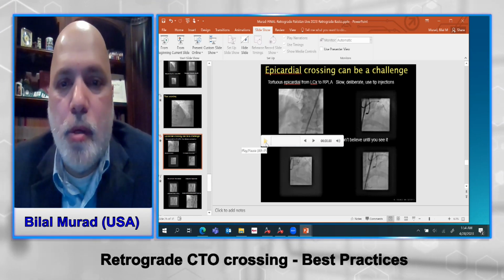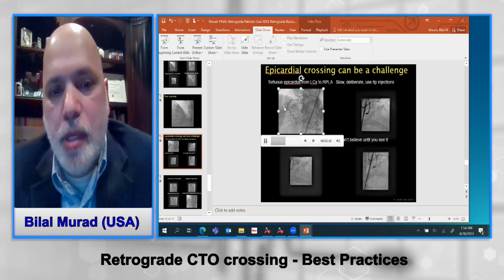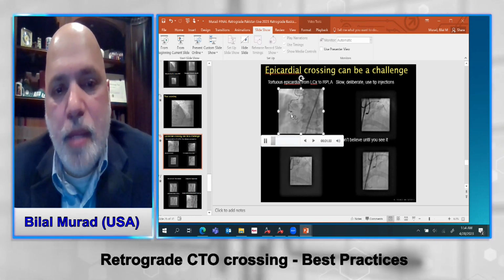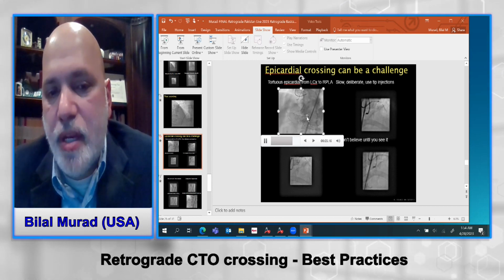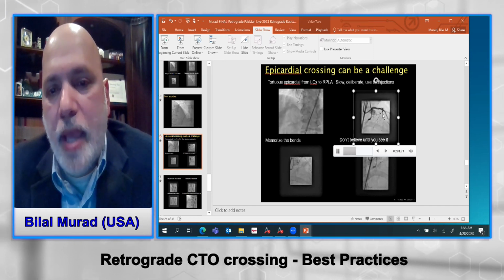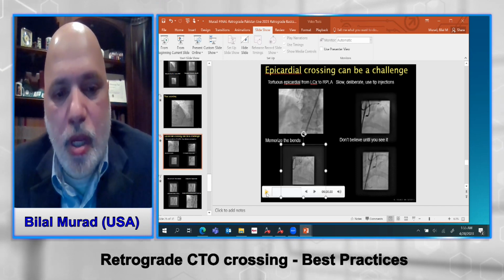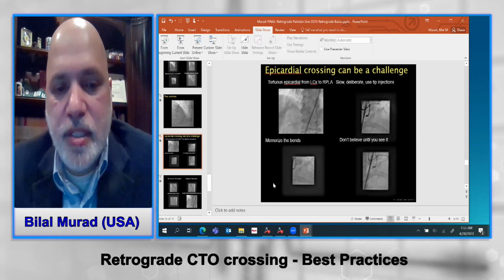Sohail bhai. So this is an example of a patient who had a LAD and RCA CTO. The LAD was dependent upon this RV marginal branch, and I had an extraordinarily calcified proximal cap, which wouldn't allow me to do IVUS-guided puncture. So my only option left was to actually utilize this very, very tortuous epicardial collateral from the circumflex artery, and I'm going to summarize about a 6-hour procedure here in just a few slides.